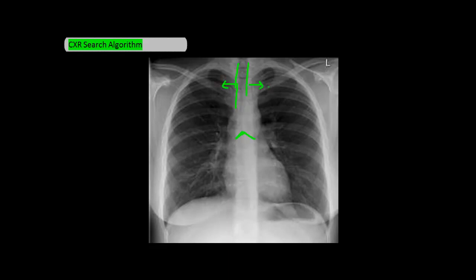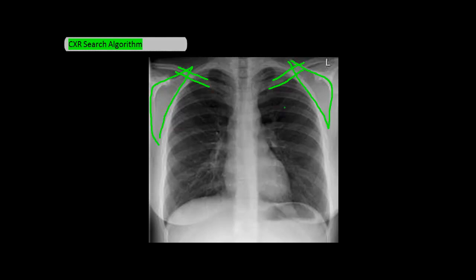Moving on to B, which is for bones. You want to look for symmetry between the clavicles — I'm highlighting the lower and upper borders of the clavicles here. I also want to look at the scapula, outlining its borders on both the right and left sides, as well as the humerus — which you can't actually see in this film — and the ribs.